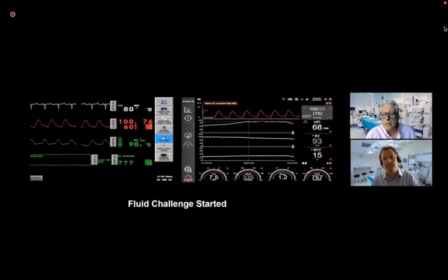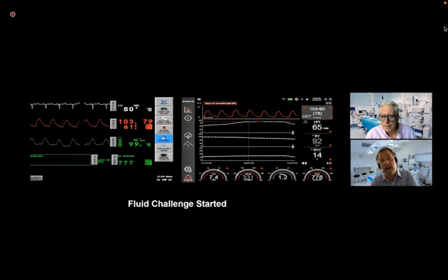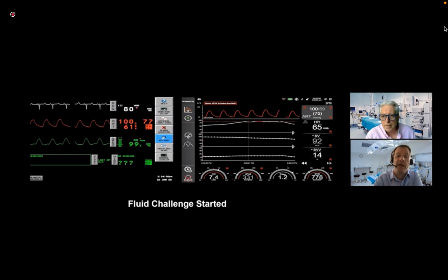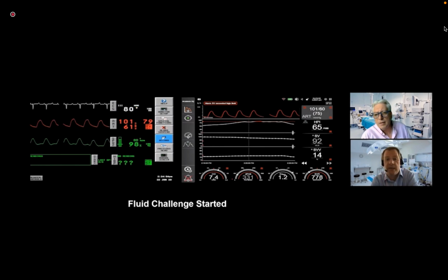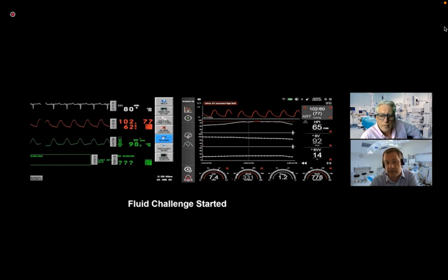So now HPI is coming down with your volume, SVV is coming down with your volume, and MAP's starting to go up with your volume? Yeah, MAP's being maintained, starting to trend upwards. And by HPI coming down, to me, what it's telling us is we're doing the right thing. We're performing an intervention, and by giving that intervention, we're taking some instability out of the system, and that's reflected in HPI starting to decrease.